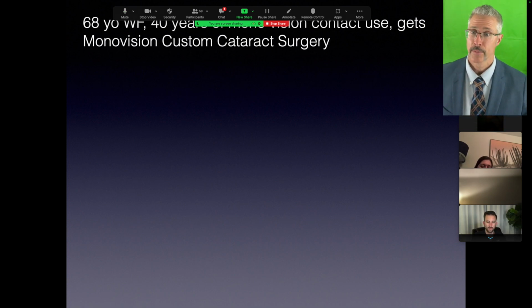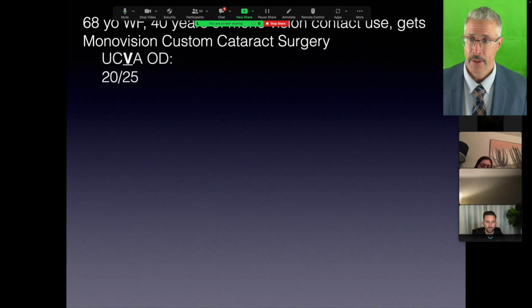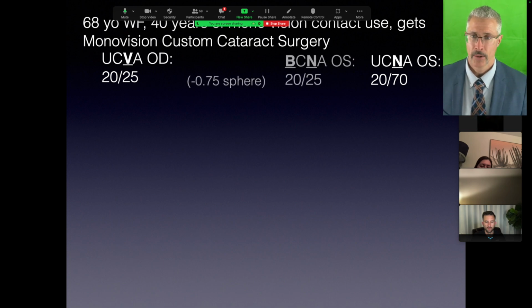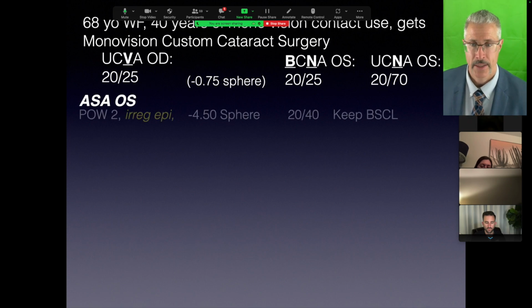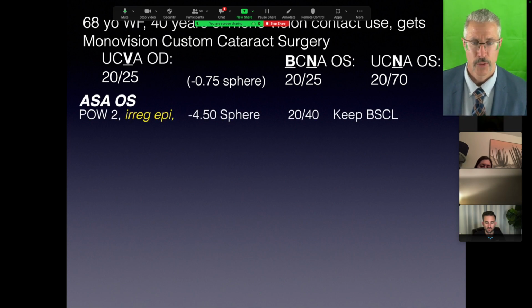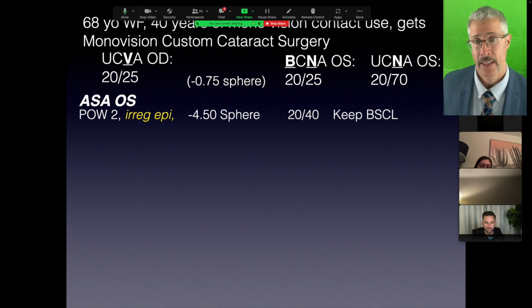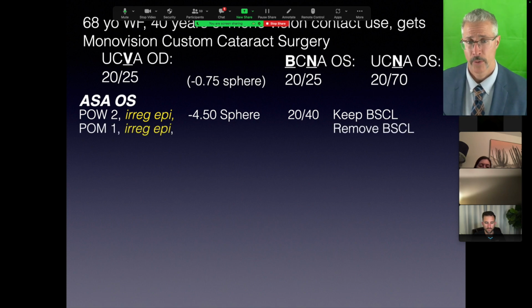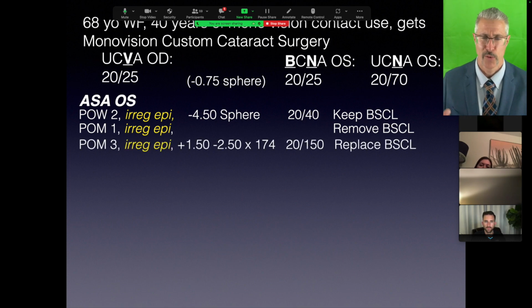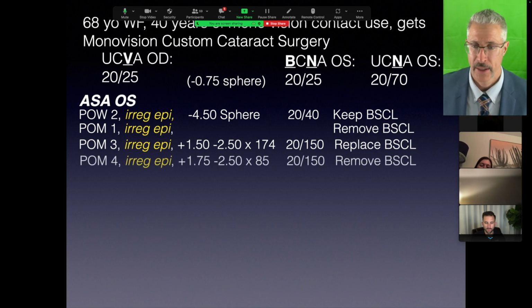Here's a case. Patient had cataract surgery, and her uncorrected near vision wasn't what she wanted. She was going for monovision. So, well, hey, let's enhance that. You're not near enough. Do some ASA. Okay, you're looking like you got a little overcorrection there, 20/40, but let's keep this contact in because your surface looks a little irregular. Take out the contact. Your prescription's all over the place. Why is your surface so fluctuant? Put the contact back in.